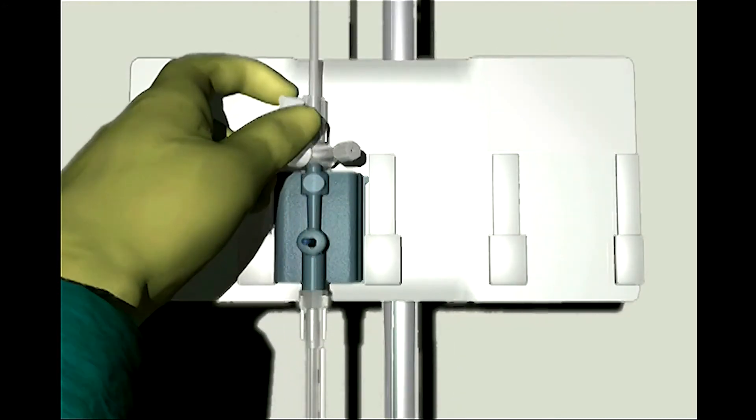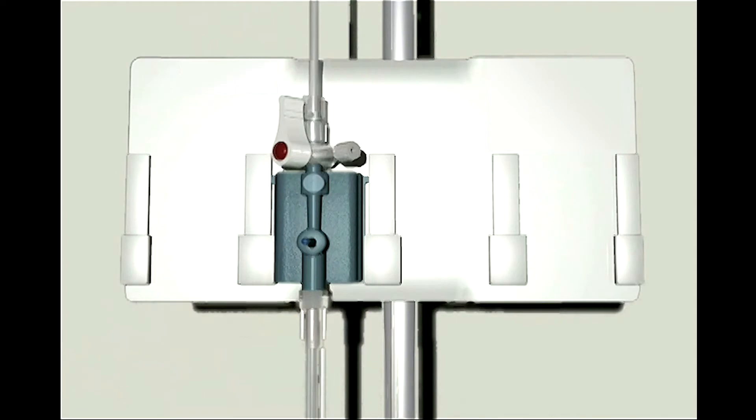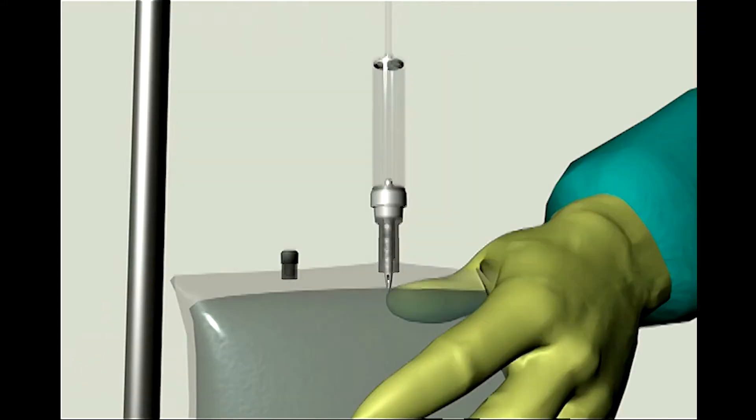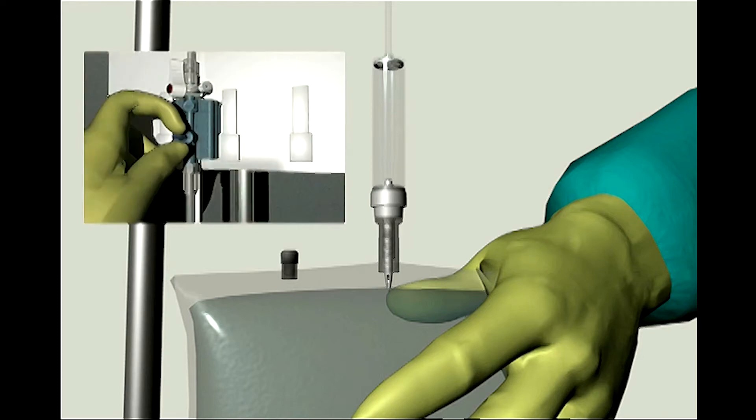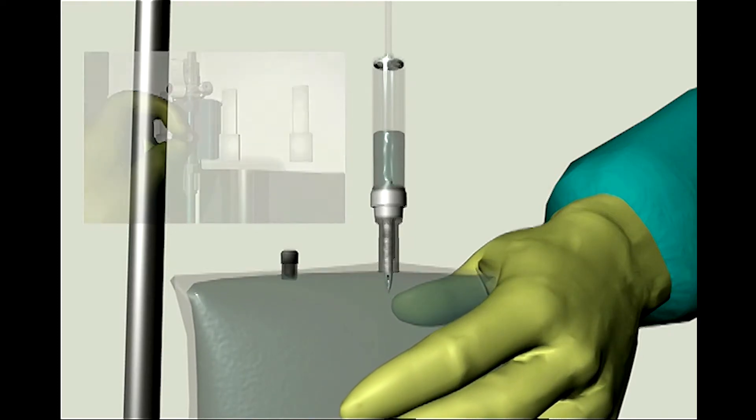Open the vent port by turning the stopcock toward the patient's pressure tubing and away from the transducer while leaving the vented cap in place. While keeping the IV bag inverted, gently squeeze air out of the bag with one hand while pulling the snap-tab flush device with the other hand until air is emptied from the IV bag and the drip chamber is filled at least halfway, per institutional policy.